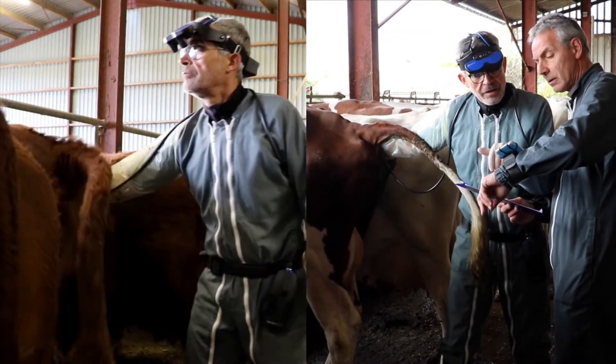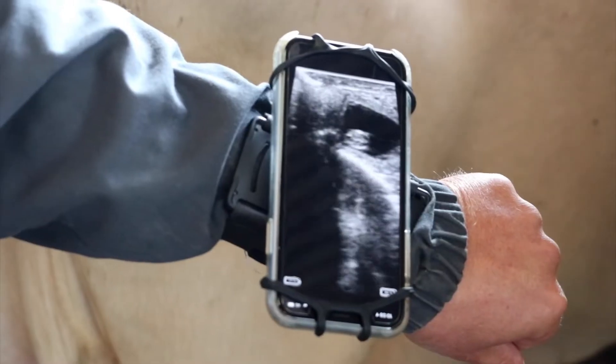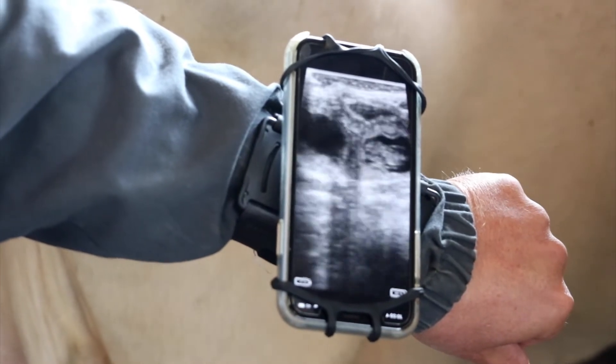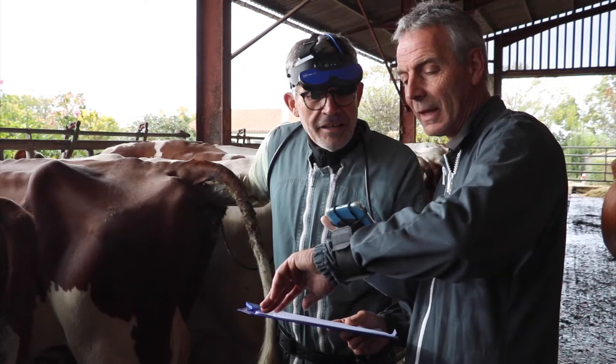EasyScan GoLite — a durable wireless scanner for pregnancy detection. Scan animals on the go without image lag and view the images on a mobile device or the wireless goggles. You'll never have to worry about catching a cable again.